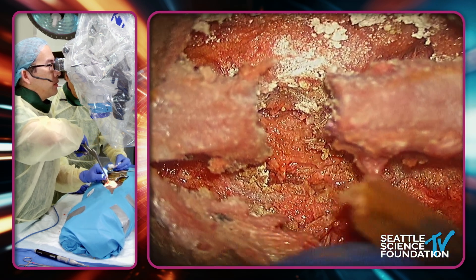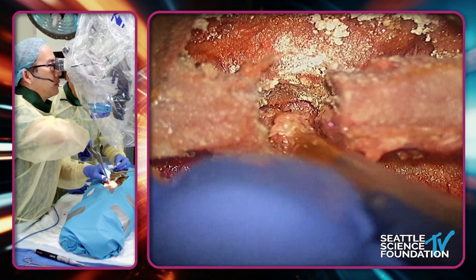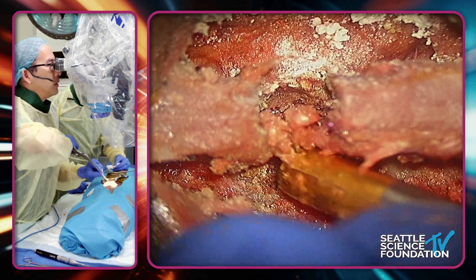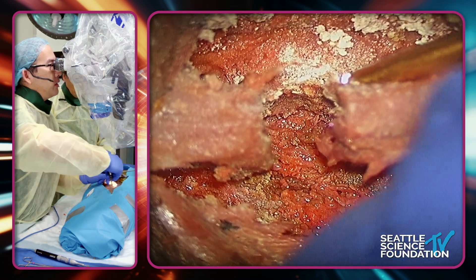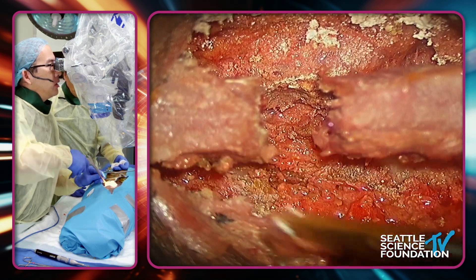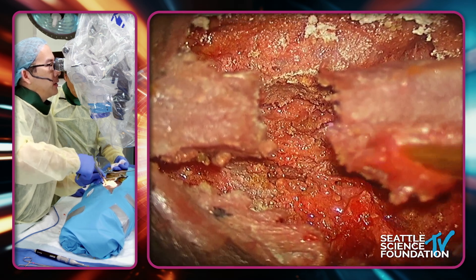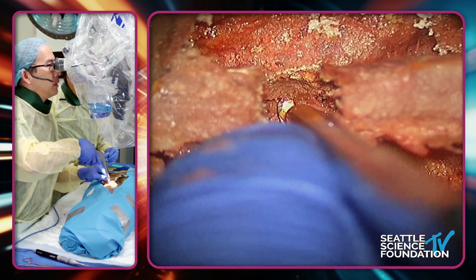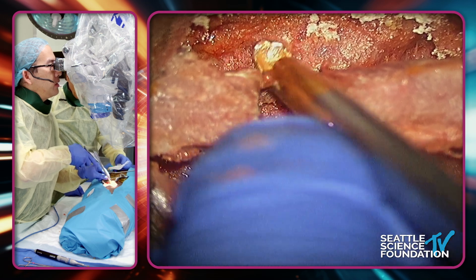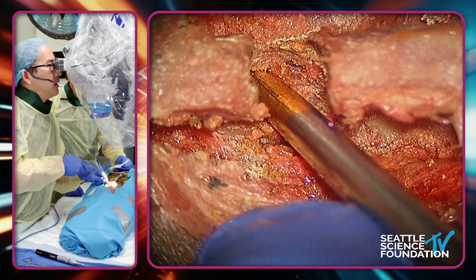A mesial facetectomy here on the contralateral side — so that's the landing zone. While you're doing this, the assistant can help by debriding all this soft tissue, and that's what my PA usually does. You're trying to make the prettiest carpentry you can because that translates into a really nice implant. Notice this is the top part of the facet — the superior facet. The inferior facet is going to be below; that's going to be the key to decompress the lateral recess.